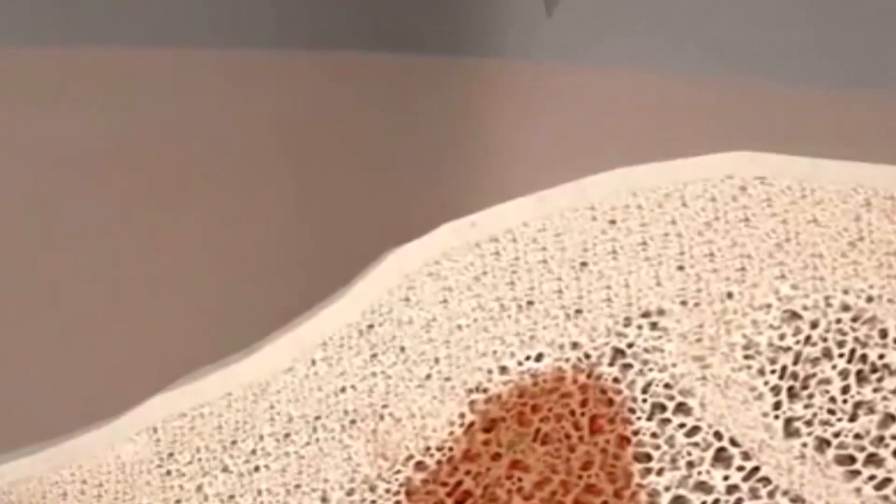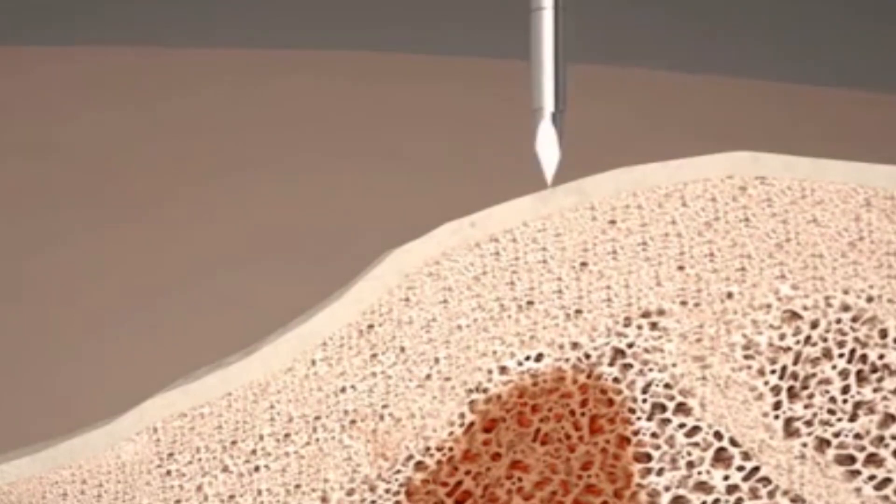It is rotated counterclockwise down to the surface of the bone, thus minimizing trauma to the soft tissue. At the bone surface, the introducer is now advanced with a back-and-forth motion until the tip of the cannula is anchored in the periosteum.